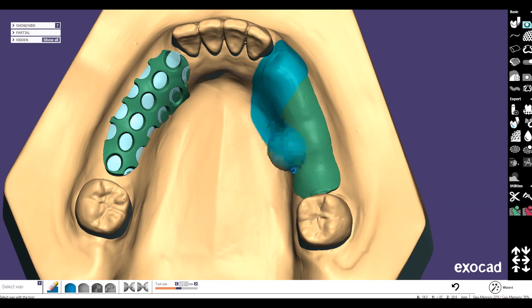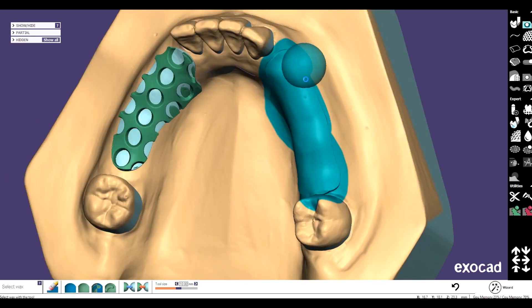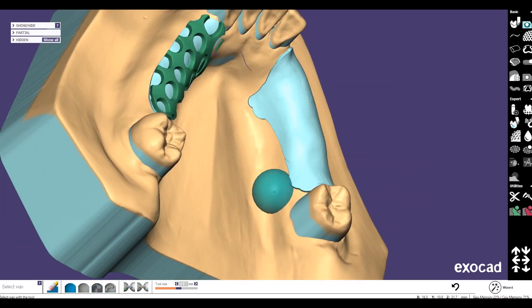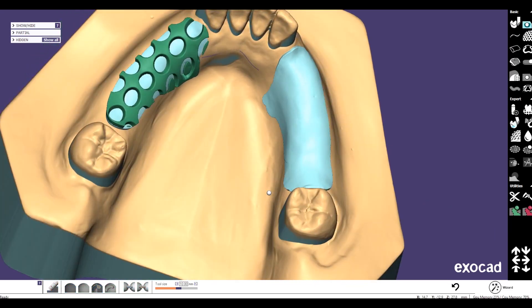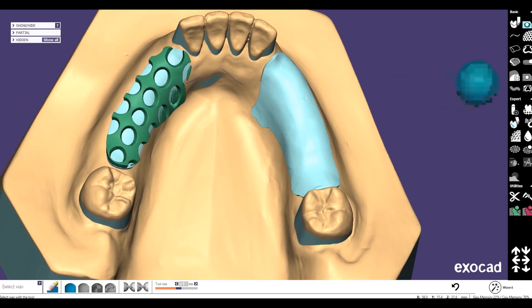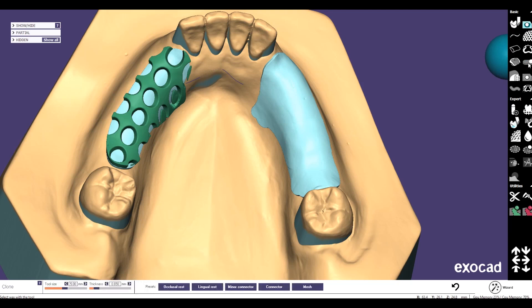First the block out works, then we switch to the tool called 'select wax.' Here we can select the wax we have marked with the clone wax tool. Now we have this symbol which is 'add selection to block out works,' and now you can see we have the black block out works — and we didn't need a curve or anything like that.